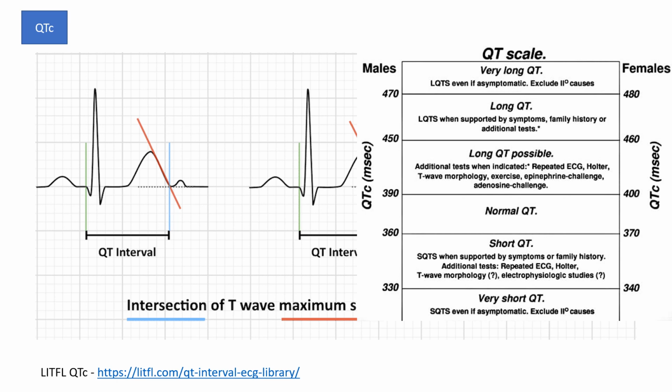But other references would say that normal depends on if you're male or female, but I think 440 to 460 is kind of the normal-abnormal bell curve measurement. But then above 500, it becomes dangerous. It begins to become dangerous. And then there's, I guess, kind of a dose response curve there. But I'm not sure how linear it is.